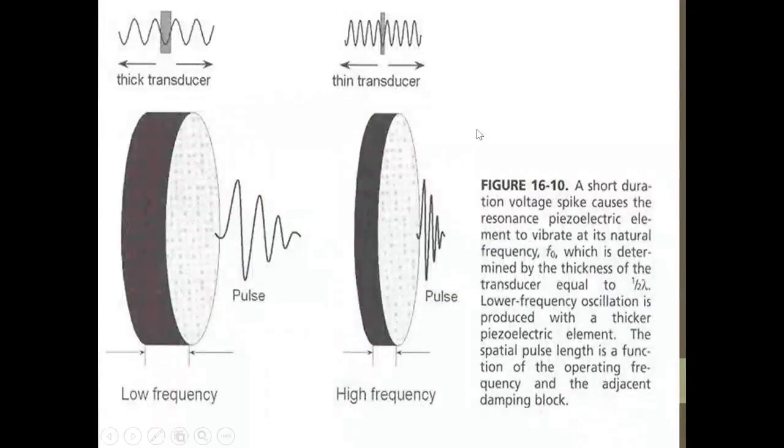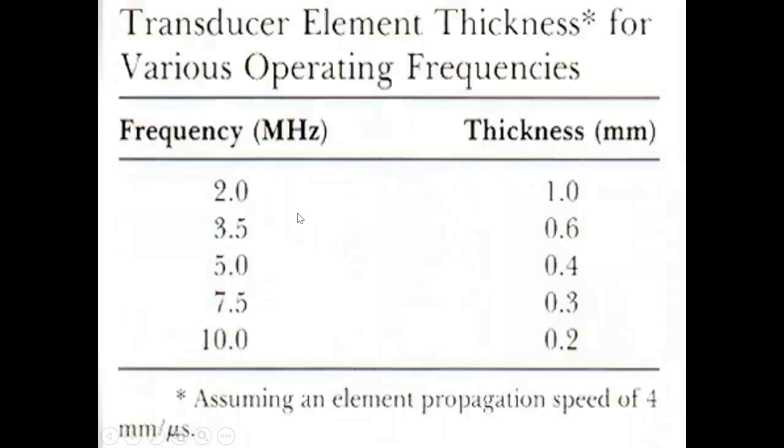We also talked about the transducer and why the crystal technology is chosen. The wavelength that I want to work on is for the topic of resonance, to produce a wave that is entirely in phase without experiencing destructive interference. I mentioned that the more I reduce my thickness, the pulse I get will have a high frequency and a short pulse length. The result, of course, is that my wavelength is short, unlike using a thick crystal, which will give me a long pulse length and a low frequency.